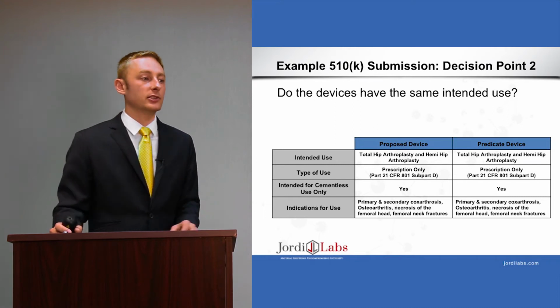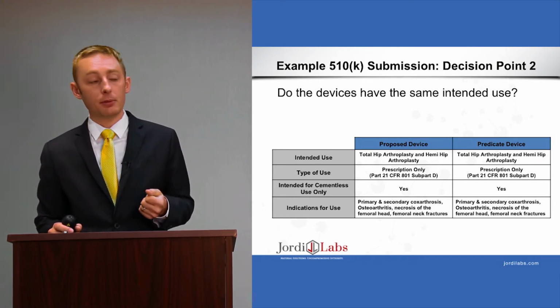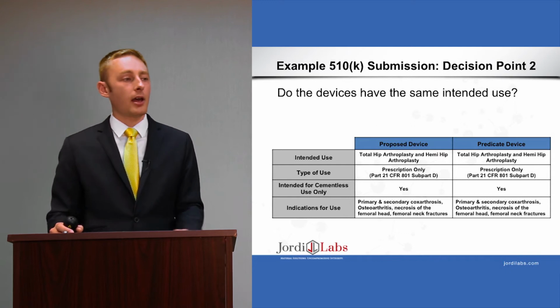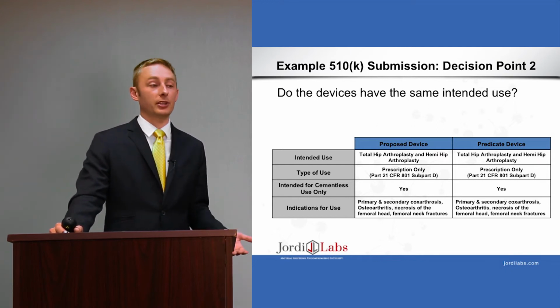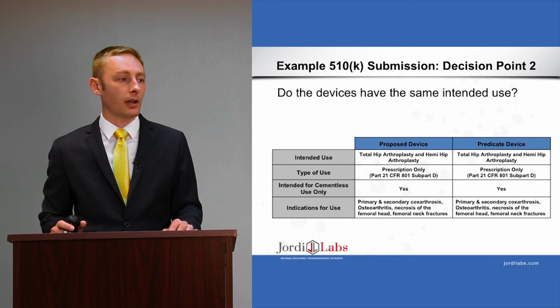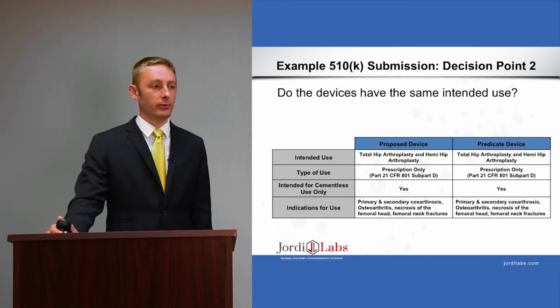And then specific to femoral heads and to hip implants, there are certain other aspects, for example, whether this is a cementless use only or whether it's cemented. That's dependent on the guidance documentation for that particular device class. And then it also provides the indications for use: primary, secondary replacement, osteoarthritis, necrosis, basically anytime you have to replace your femoral head.